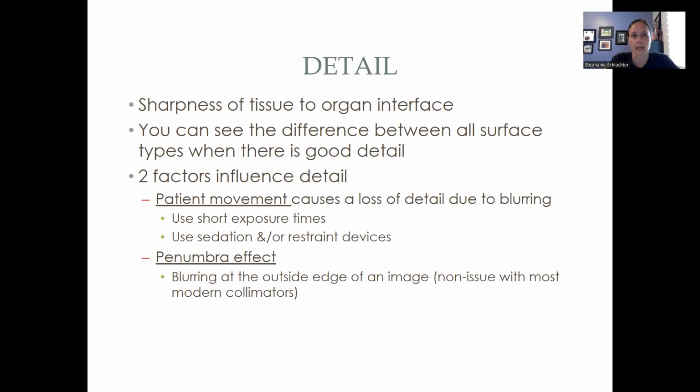So what the heck does that mean, right? Again, how well can you make out different tissues from one another? So how detailed, right? I mean, kind of what we think about with details with anything, right? How finite is something that you can see, okay? So when we can see all of those little differences, then we know we have good detail in our image.